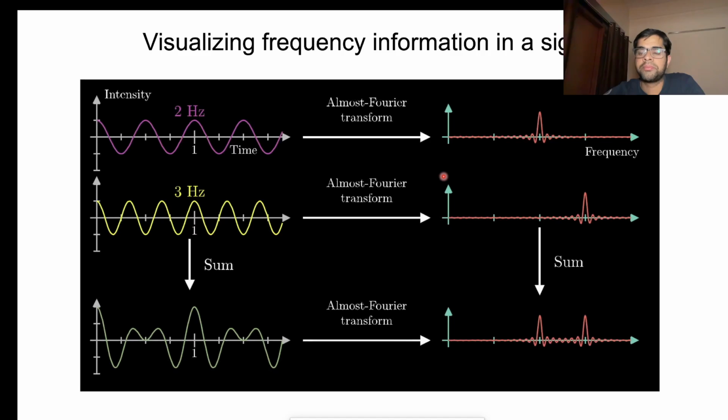A signal with a lower frequency, from time 0 to whatever time you have measured. So that's the fundamental question that I think is generating his doubts. Correct. These axes are entirely different. This is time. It shows, as time progresses, how the voltage of a signal goes, or how the music's air compression goes. But here it shows a different axis.